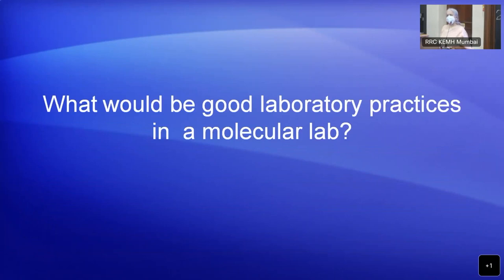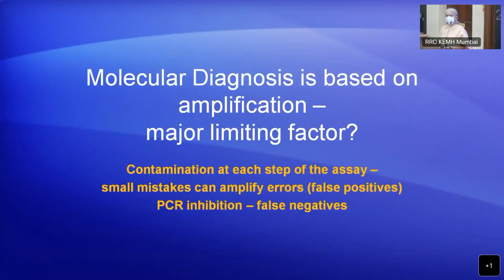So what do you think would be good laboratory practices in a molecular lab? What are the things that we need to look at? What are the limiting factors in molecular diagnosis? The first limiting factor is contamination. At each single step of the process, there is always a chance or risk of contamination. So there has to be contamination control. If we don't have contamination control, what result can we get? False positives, right?